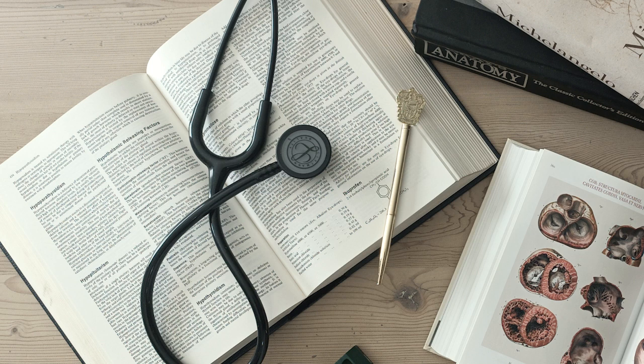There's no discernible rhythm, no organized electrical activity. It's impossible to differentiate any organized atrial or ventricular events. It's just electrical anarchy. And clinically? Clinically, the patient is in cardiac arrest, unresponsive, pulseless, and apneic, not breathing. The heart is merely quivering chaotically, not effectively pumping any blood. This is full cardiac arrest, requiring immediate CPR and defibrillation.